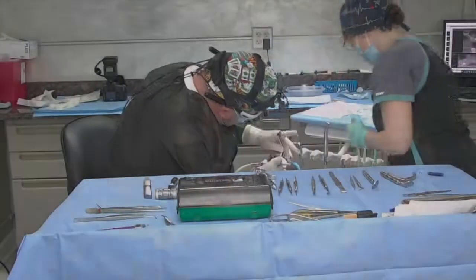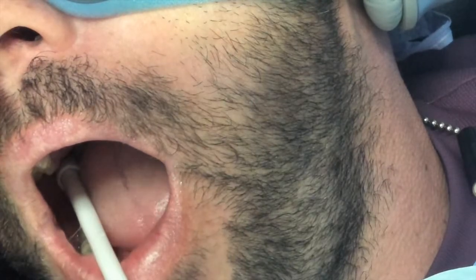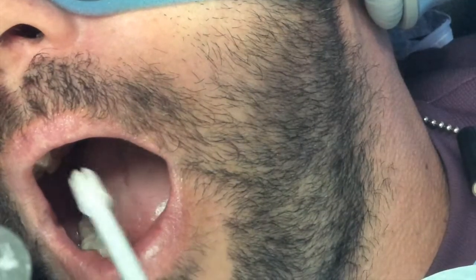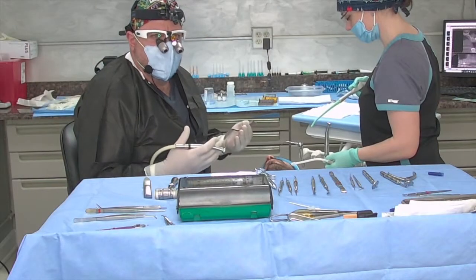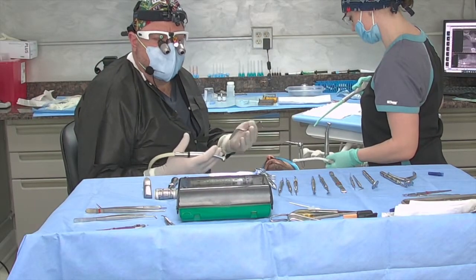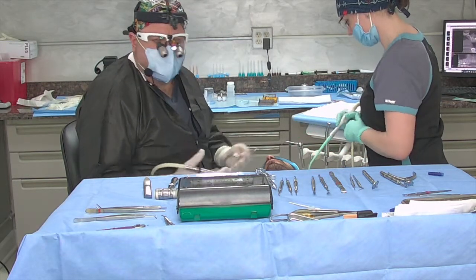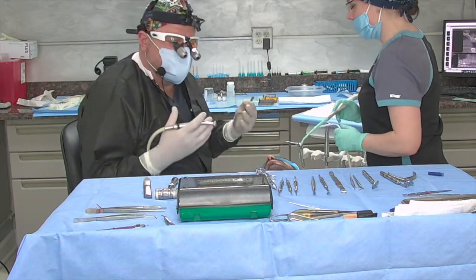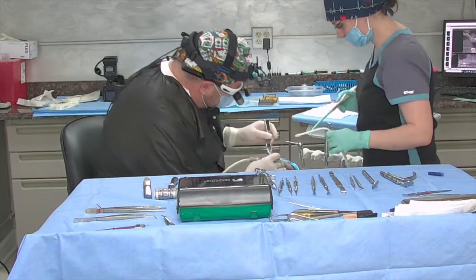Okay, so first thing we're going to do now, and we'll turn a little towards me. Understanding that, obviously, we have filled in, from a guide standpoint, I'm going to create the natural emergence profile, what he should have at this site. The best guide I'm going to have is creating a tangible contour that he should have, and then I'm going to be in the center. Obviously, you could do this guided. You could do this with the stent that I've used over and over. There's different options.